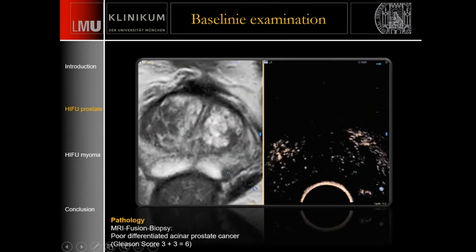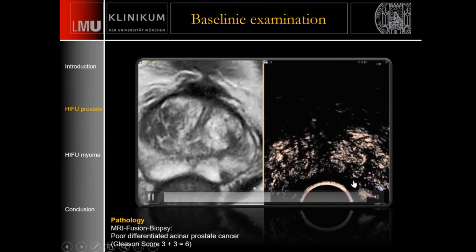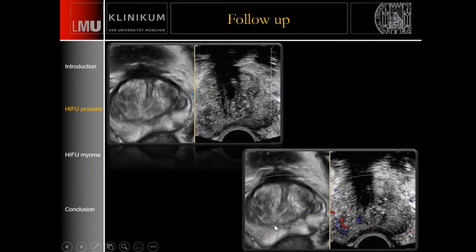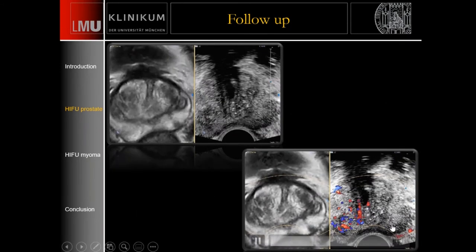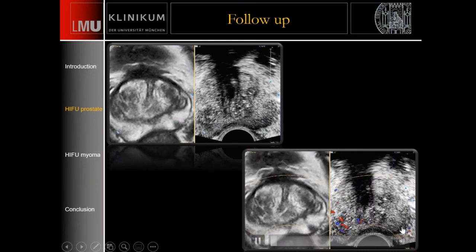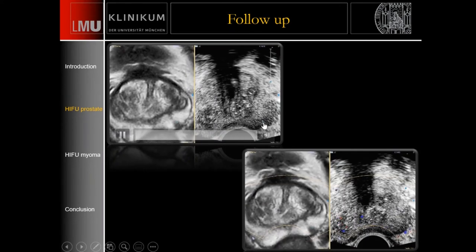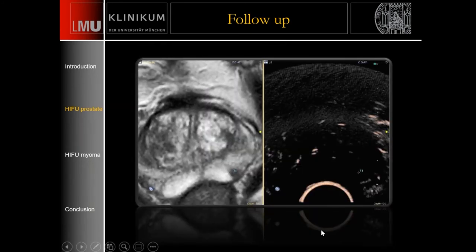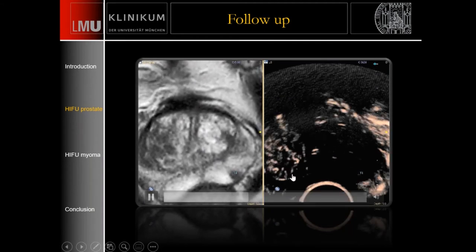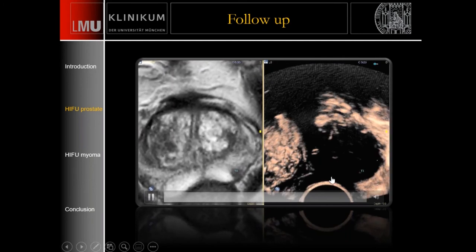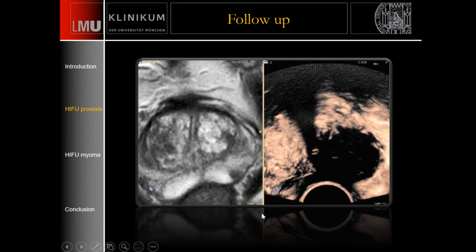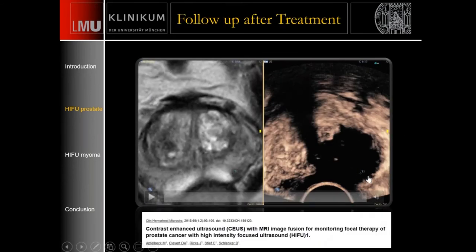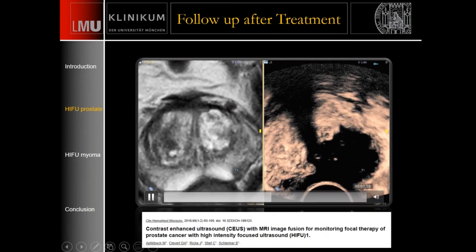After contrast injection at baseline, the lesion shows atypical contrast behavior — less contrast uptake compared to the rest of the prostate. In follow-up Color Doppler, the vessels previously seen are now missing — an indirect sign of successful treatment. The cancer is still visible in grayscale, similar to the MRI appearance. On contrast re-examination, there is nice perfusion of the right lobe and a perfusion defect in the left lobe — confirming successful treatment of this small prostate cancer with a diameter of roughly 7 mm.